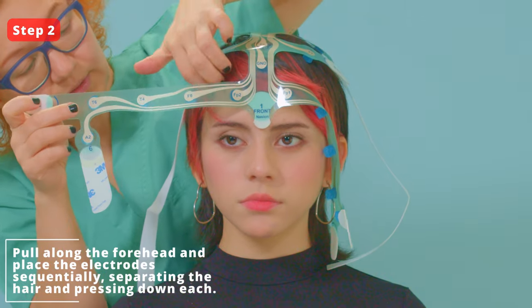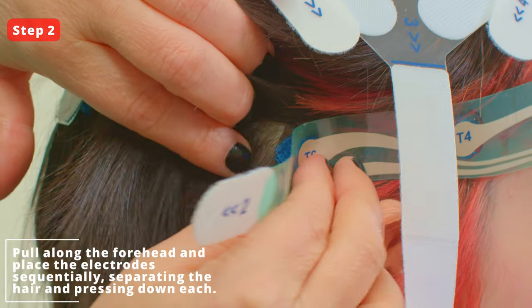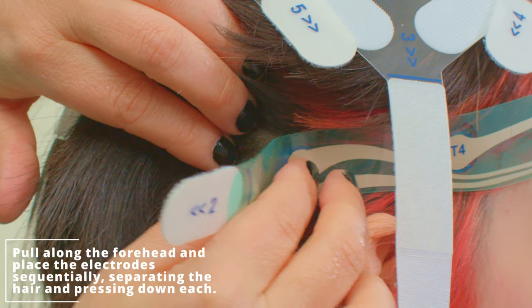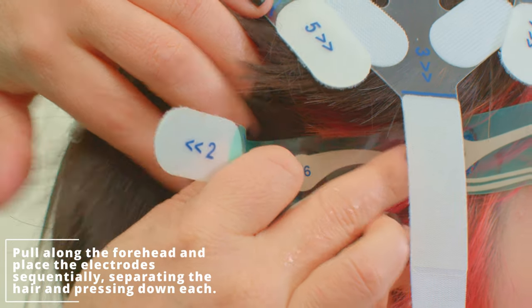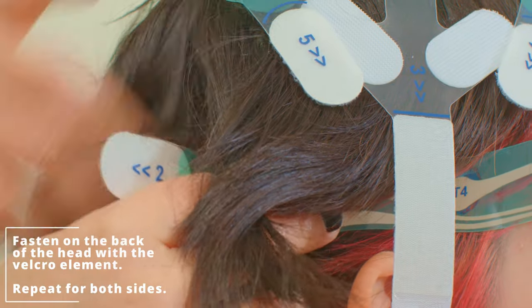Step 2. Pull along the forehead and place the electrodes sequentially, separating the hair and pressing down each electrode. Fasten on the back of the head with the number 2 Velcro elements. Repeat for both right and left sides.